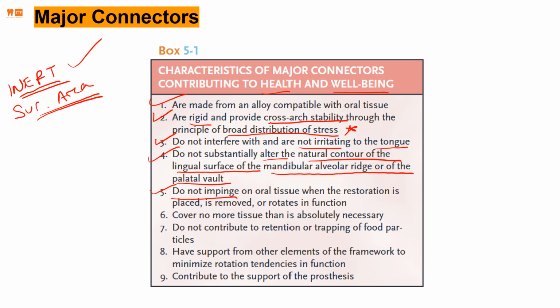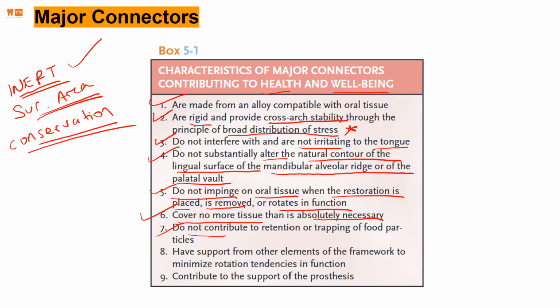Does not impinge on oral tissue when restoration is placed and removed or rotates in function. Impingement, same thing again. Covers no more tissue than absolutely necessary. Of course, let's add here conservation.